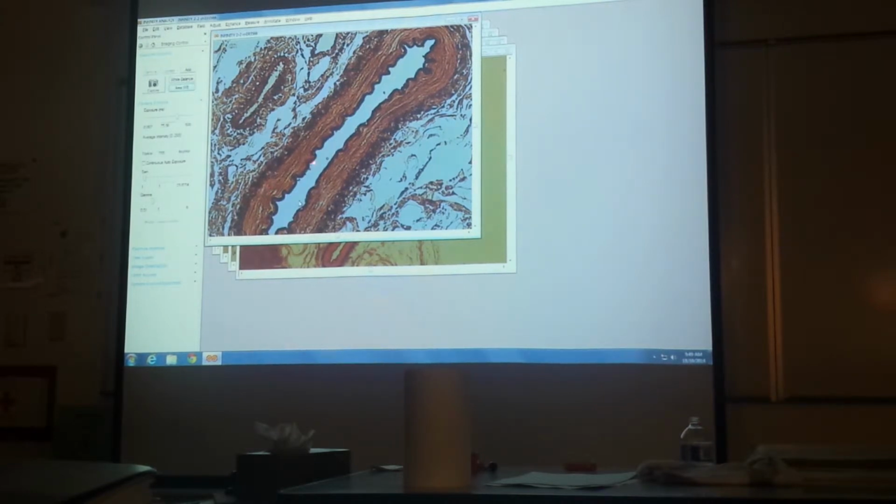I can see a nice internal elastic lamina, but what tunic is that? Tunica intima. If I say identify the structure, what do you think I'm asking for? Internal elastic lamina. If I say identify the tunic, well then it's obvious, right? So what tunic is that? Tunica media. What if I ask you to identify the kinds of cells that are in there?